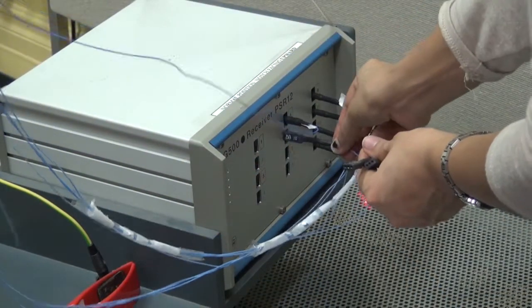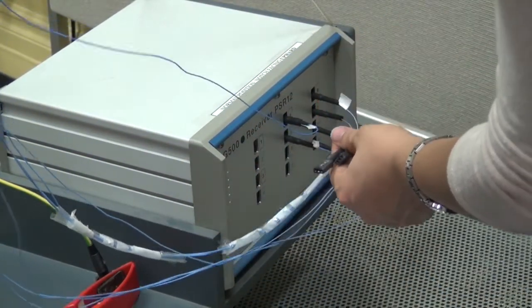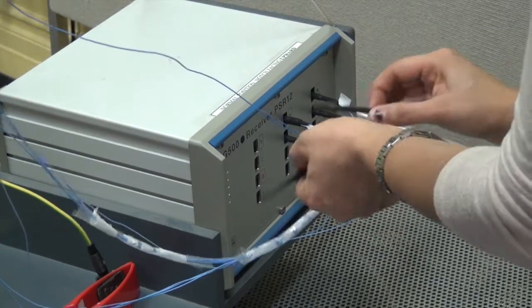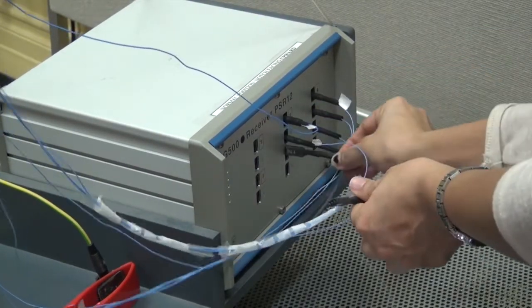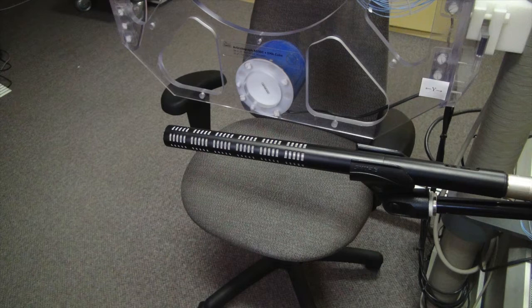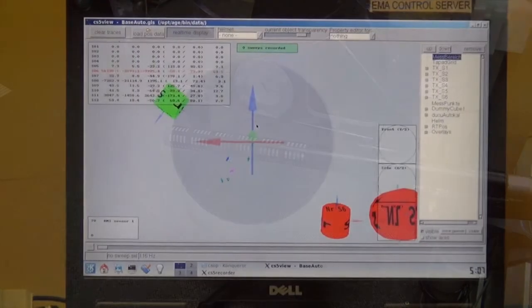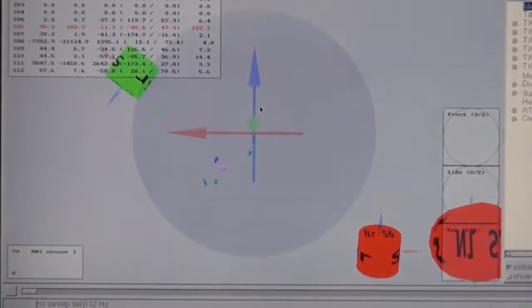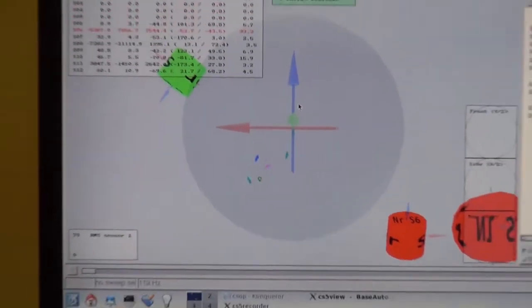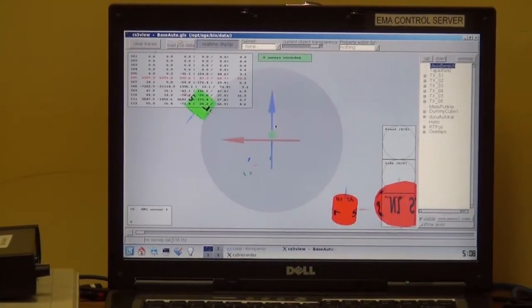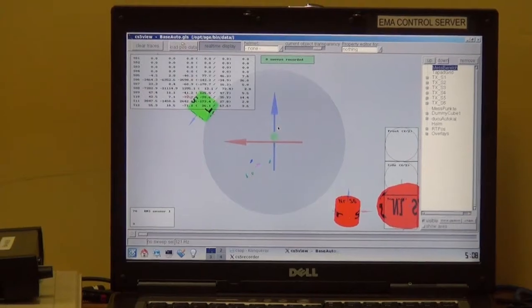An analog unit converts the receiver signals into data, a high-quality microphone records the acoustic signal of the productions, and software for data analysis graphs the sampling of the electrode's positions.